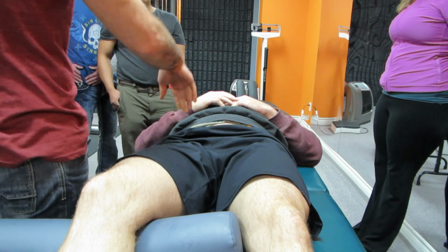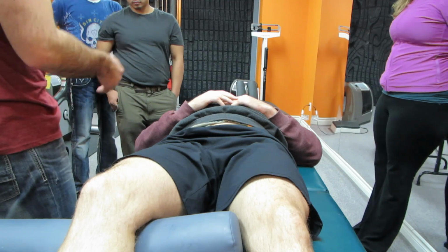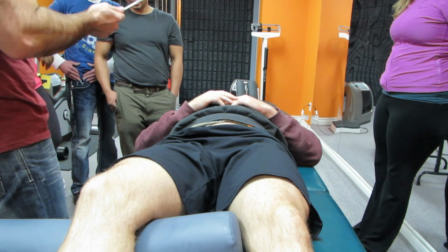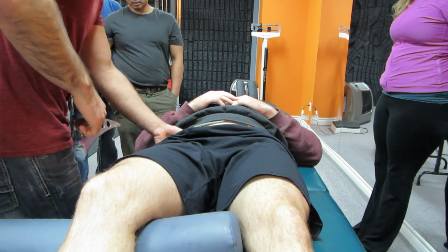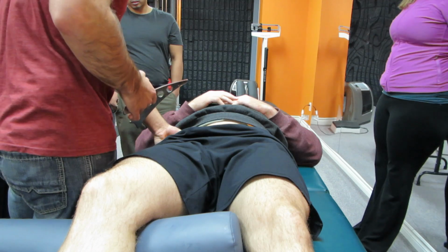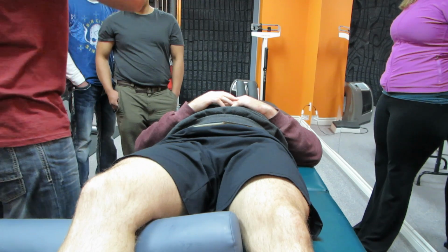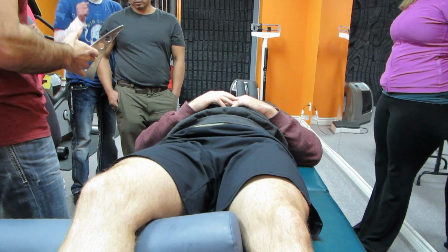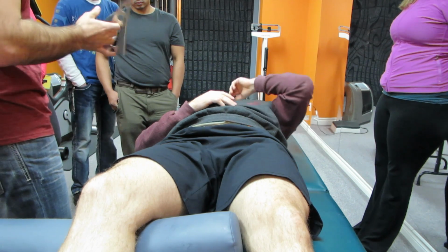With the psoas higher up, it's obviously under way too much stuff that the only way to really get in there is to dig your hands in there sometimes. With this tool, we can treat around this area here, but in that case, I always get a partner to help me come and hold his leg and slowly bring it down till I find that line of tension and everything like that. Okay? Are we missing anything?